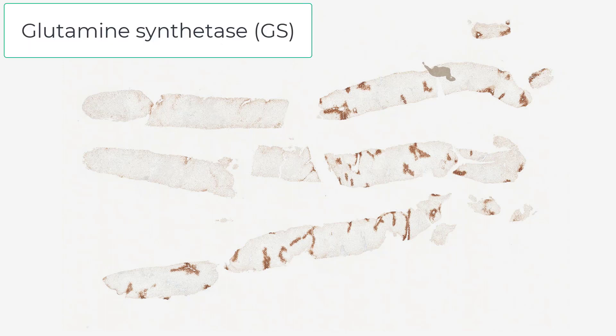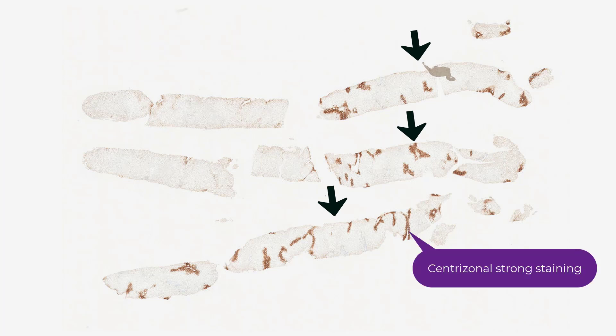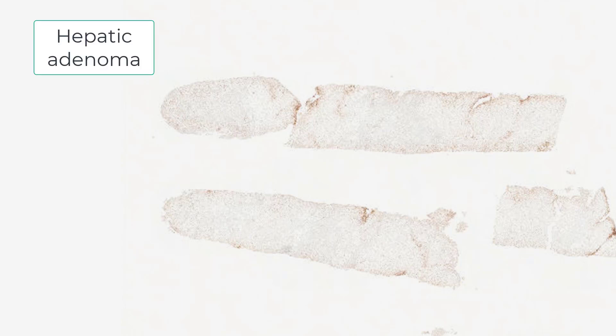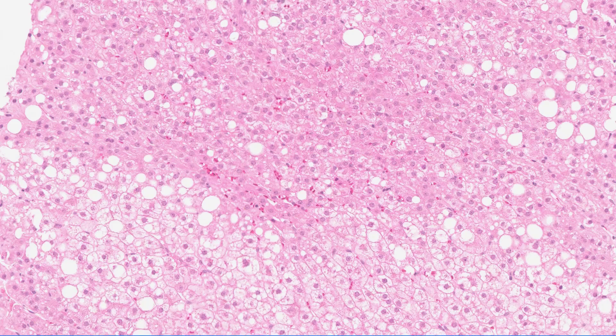If you have this stain — this is glutamine synthetase, or GS — believe me, this is the next best thing after sliced bread. Because right off the bat, it tells you several things. It tells you that this, this, and this is all normal liver, because you see that strong centrilobular staining for GS. That piece and that broken piece is lesional tissue because it lacks that staining. There is no other stain that can do this for us, as far as I'm aware, and do it so brilliantly.